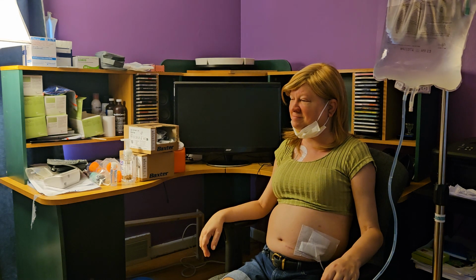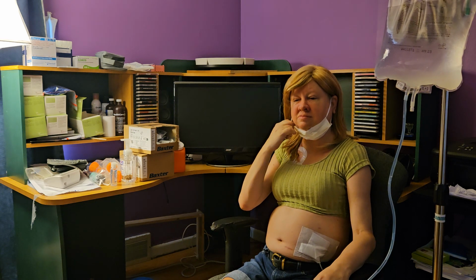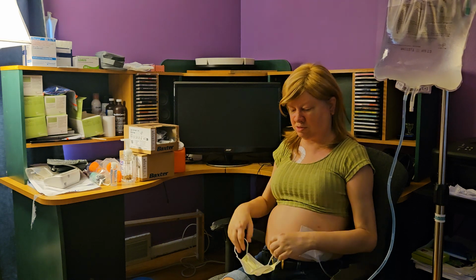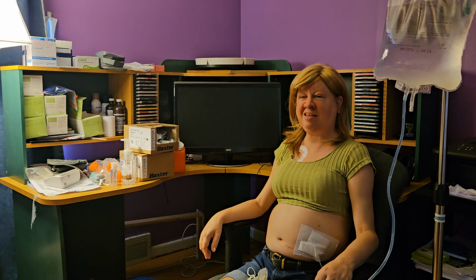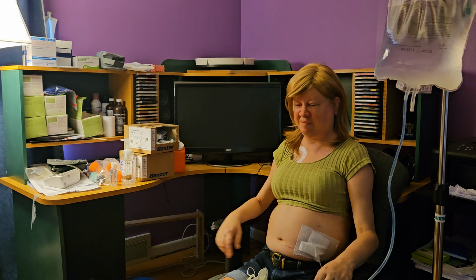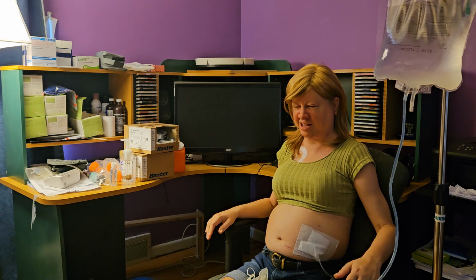Time's up. 2:48. Takes about 10 to 15 minutes to drain. First 5 minutes I don't feel anything, and then I start feeling some, like, what they call drain pain. It's like cramping in your stomach. I watch my stomach deflate.